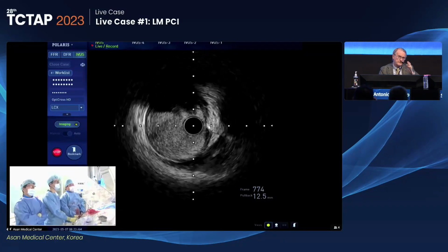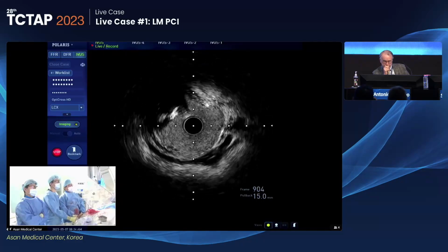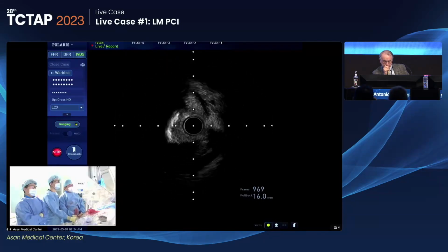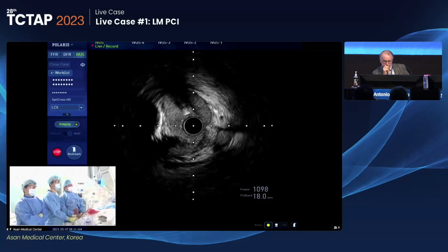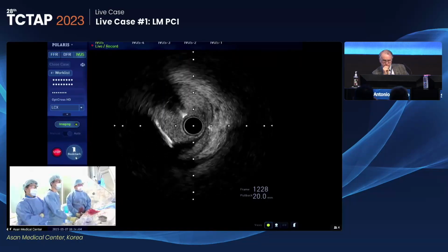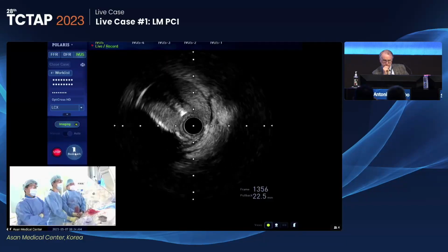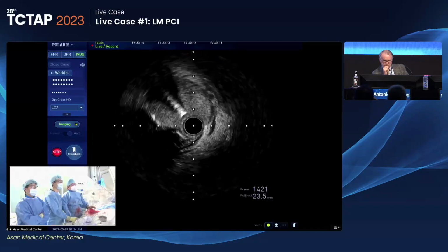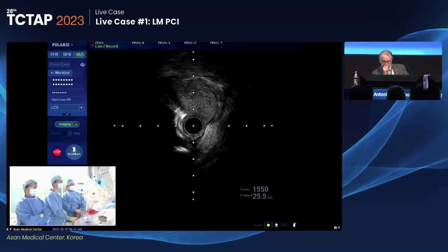So you've got a bit of a dissection and a bit of a hematoma we just passed by. Yeah, right. Here's another dissection and a hematoma. Very interesting, from 3 o'clock to around 7 o'clock. But this is balloon effect. This is what balloons do in calcified lesions. Well, Gary predicted that the circumflex is going to give nicely. You see, again, well dissected.